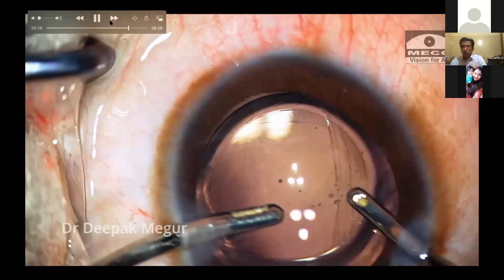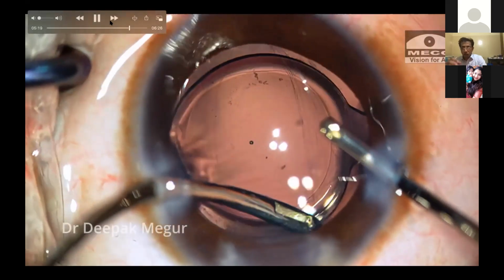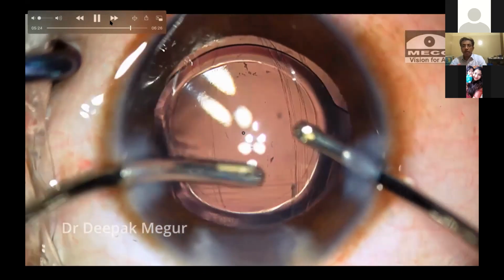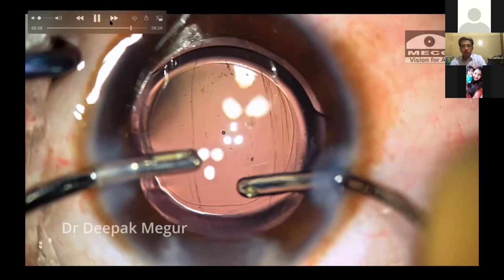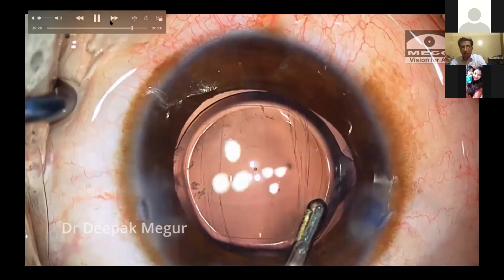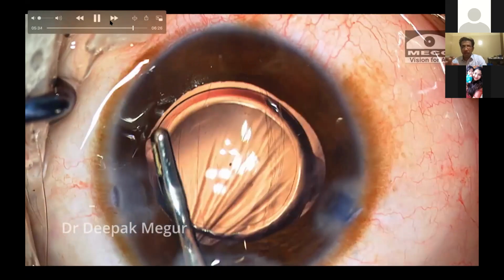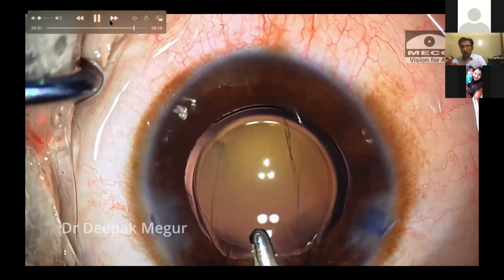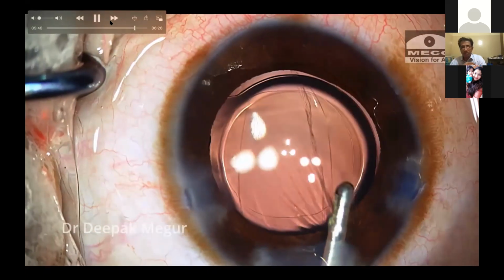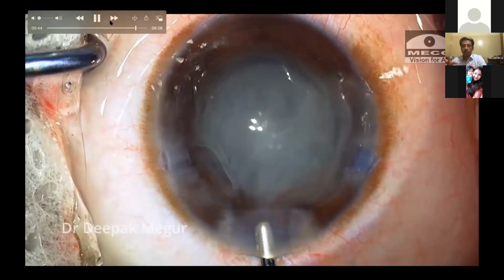Again, the message would be, it will take some time. It will take another 5 to 10 minutes extra to carefully irrigate out and aspirate out all the OVD which is there, but it is possible. So, it's not necessary for you to leave the OVD. Maybe you can just leave a little bit. But if you're careful, most of the OVD can be gently removed. And even, you can aspirate the cortex, which I showed in the previous case, even with a low bottle height. You don't have to have a dry aspiration always.